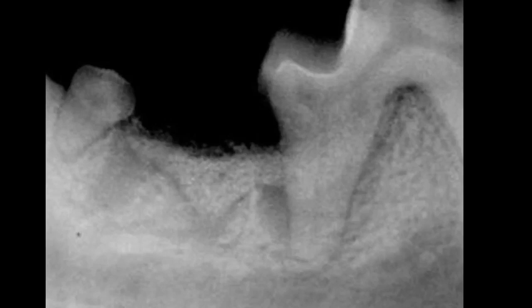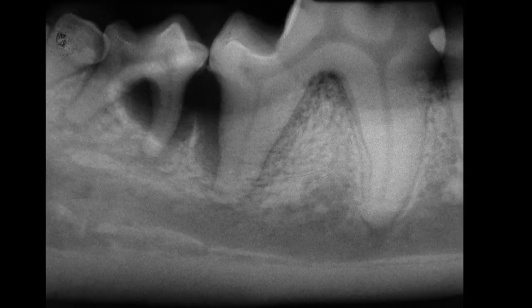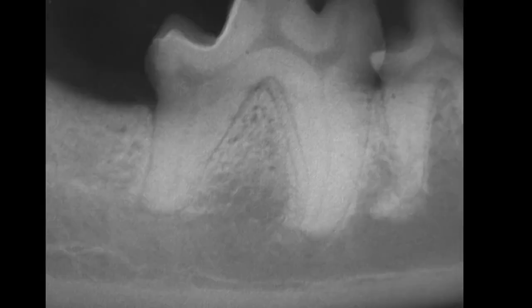Consul is an osteoconductive graft. It just forms a matrix for the osteoblasts to attach to, increases the surface area there for those to attach to. And so there are no components in there that cause the bone to grow, as opposed to another graft that I'll show you in a minute, which is osteoinductive, that does have components that will help the bone to grow. So that is before, and then that's after.